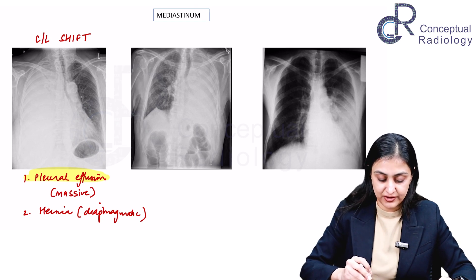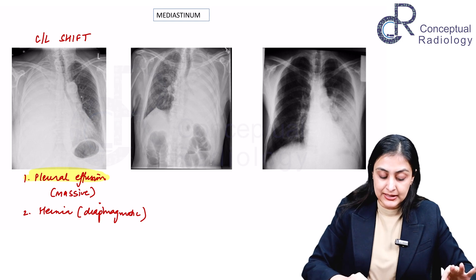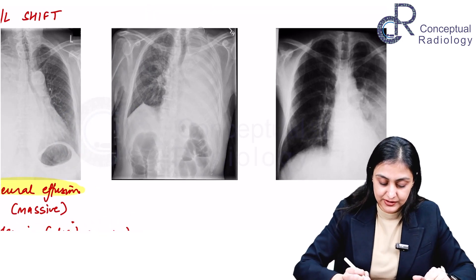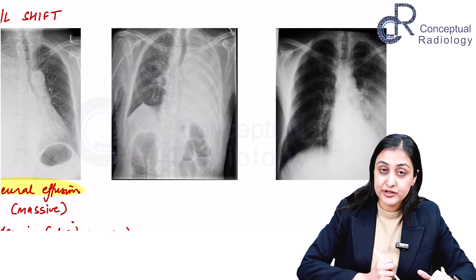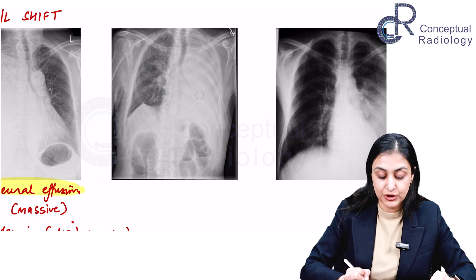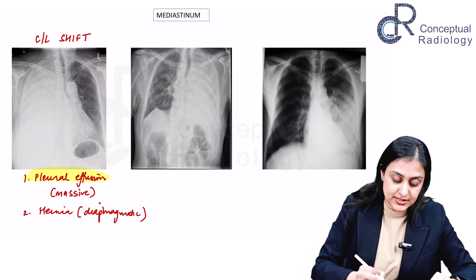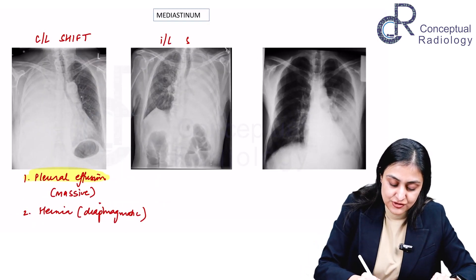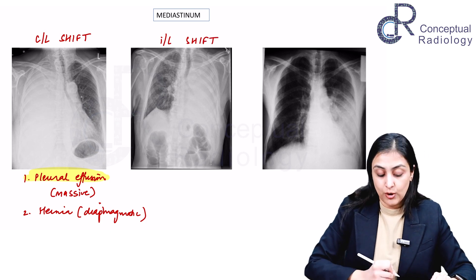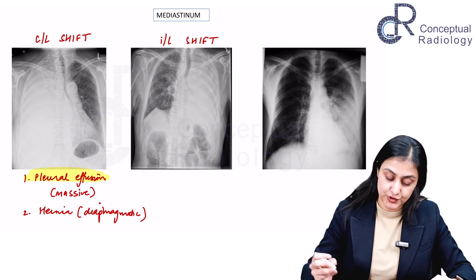Now let's talk about a mediastinum shifted to the ipsilateral side. Look at this x-ray: non-rotated, adequate penetration, good inspiration. The left hemithorax is opaque, and the trachea has been pulled to the ipsilateral side. When you have an ipsilateral shift, it means there is volume loss.